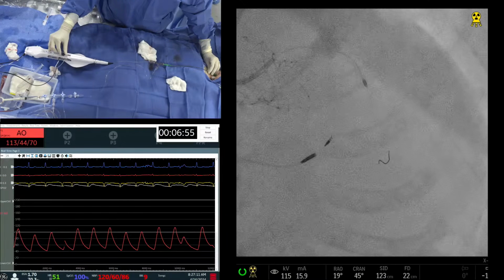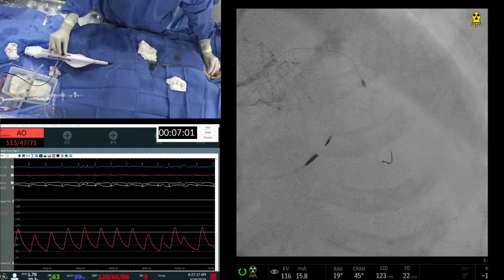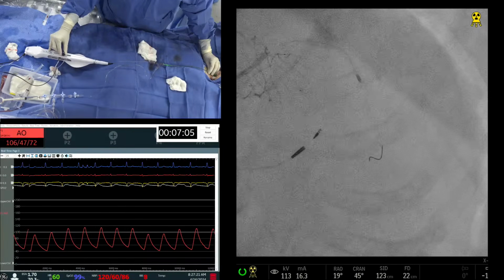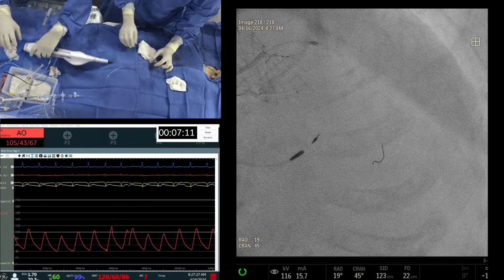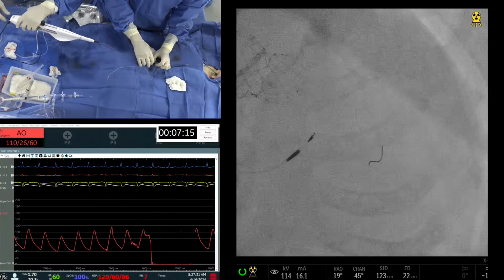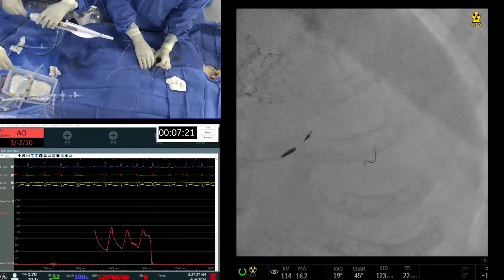Okay, crossed, right away. Exactly that pause which was needed. Done, as almost always. So this is where our goal was, and I will just stop here. Don't go beyond the angle. That was the plan, not to go beyond the angle. Now, to make it interesting, although the FFR, iFR wire will be very tough to go further, there's nothing wrong after stenting.